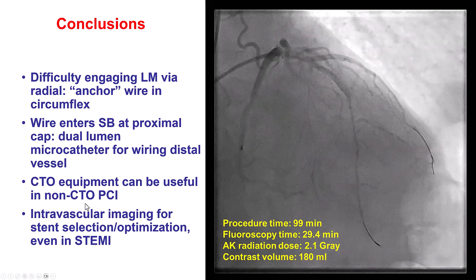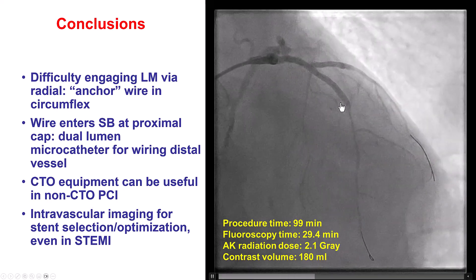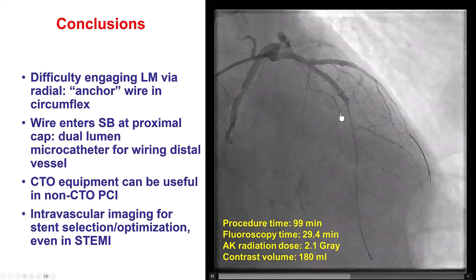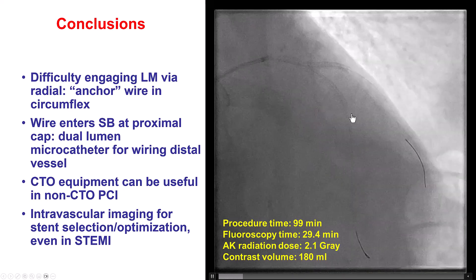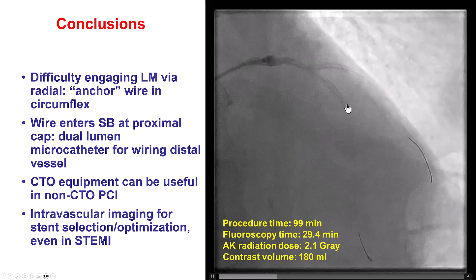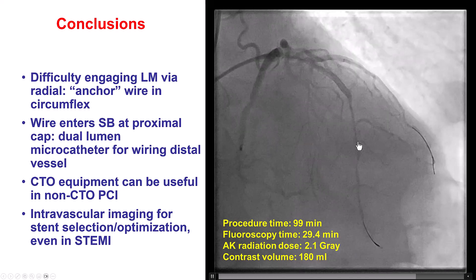Finally, we did use intravascular imaging to optimize the result. We see that the distal vessel is diffusely diseased, likely because there was a pre-existing lesion with chronic underperfusion of this segment. However, over time, we anticipate this vessel to grow and become larger.